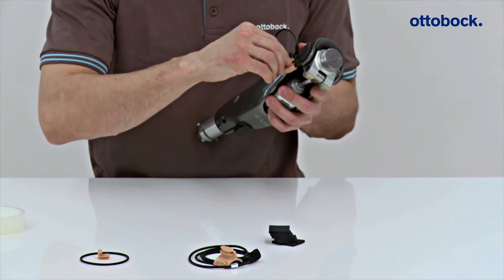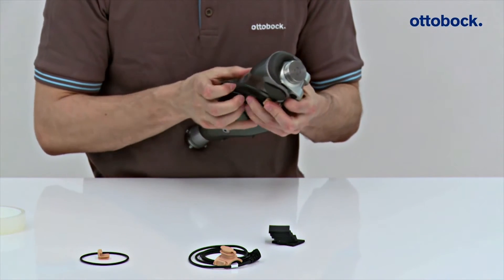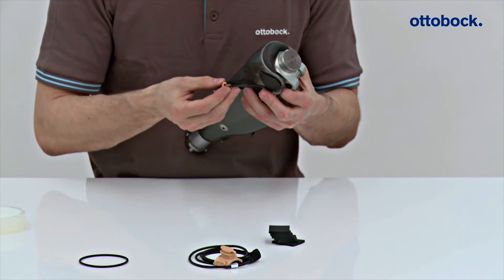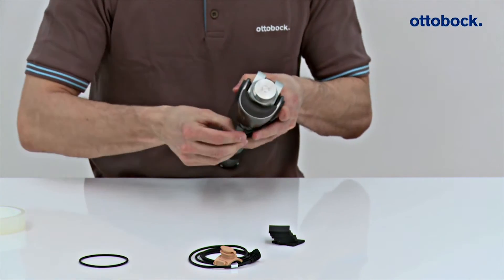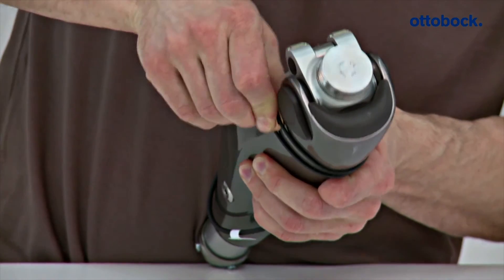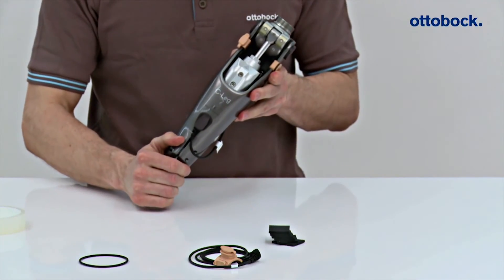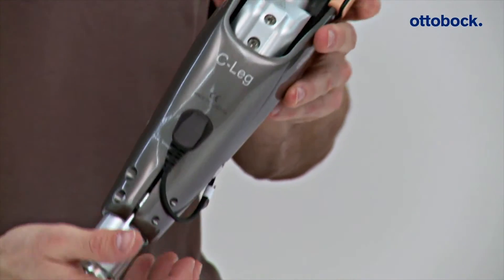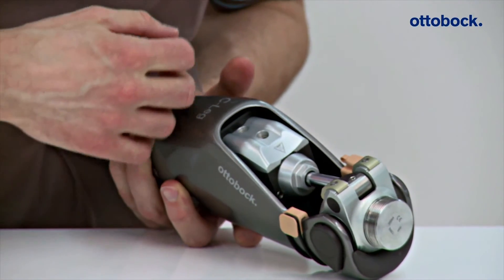Finally, the O&P Professional inserts the counterpart piece of the charging receptacle into the O-ring and then places it around the knee joint. The counterpart piece of the charging receptacle is then hooked on the opposite frame side of the knee joint. The cable and the charging plug are attached to the frame with adhesive tape.